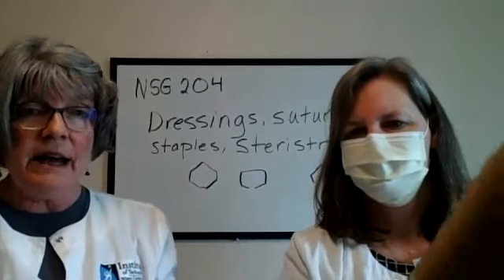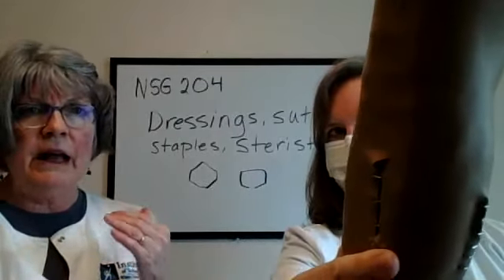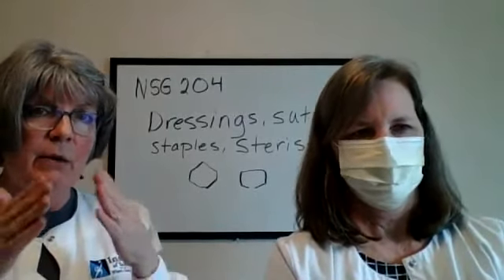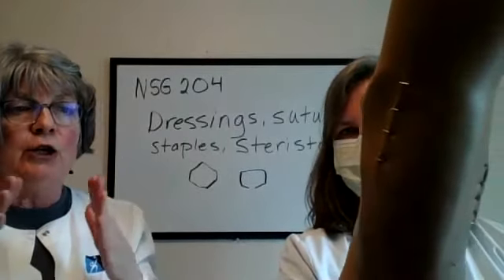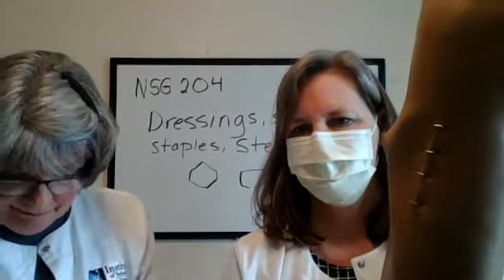The reason I say that is because oftentimes, depending on where the wound is, say it's right on a knee, when you start pulling out the sutures or taking the staples out, sometimes the wound will open up again. So you want to only take away part of the sutures and the staples a little at a time so that the wound won't open back up again.